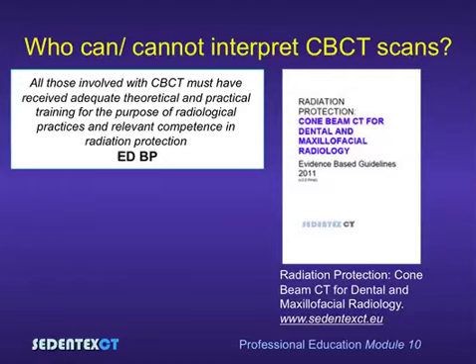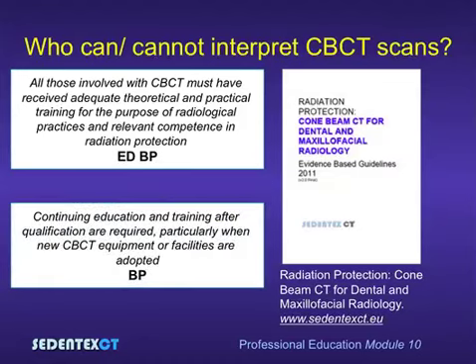All those involved with cone beam CT must have received adequate theoretical and practical training for the purposes of radiological practices and relevant competence in radiation protection. Once an individual has received adequate training, continuing education and training after qualification are required, particularly when new cone beam CT equipment or facilities are adopted.